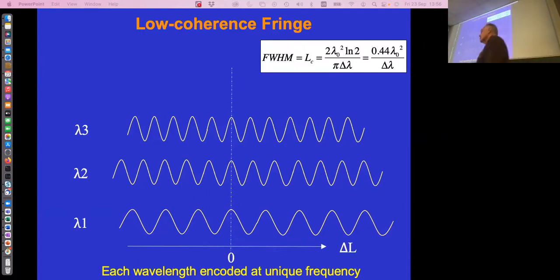Okay. So what happens now if I turn all three lasers on at the same time? What would my detector measure? They all will start to interfere with one another, at sort of regular intervals. Will wavelength 2 interfere with wavelength 1? It's not a simple question, huh?